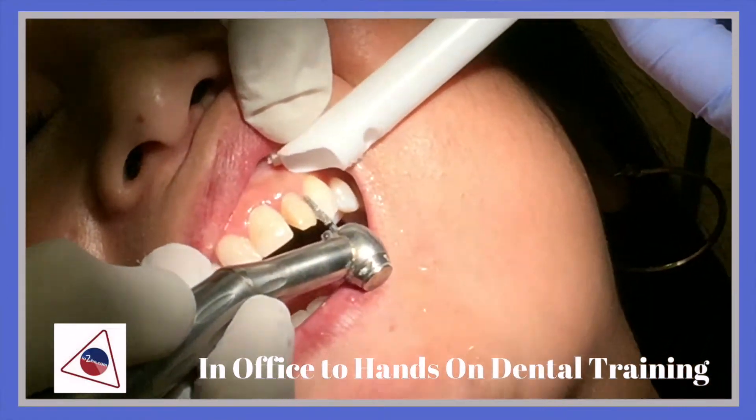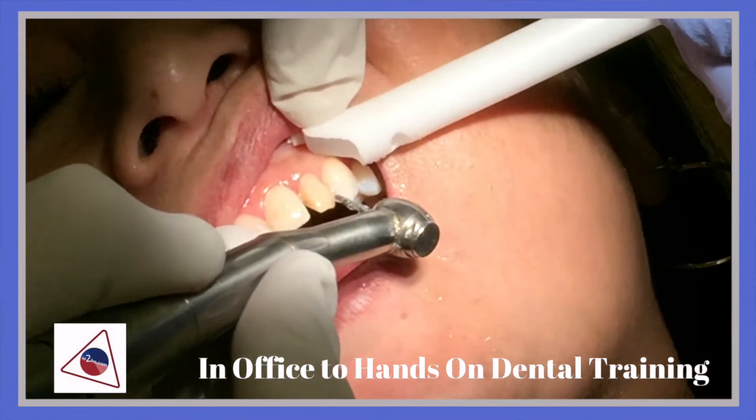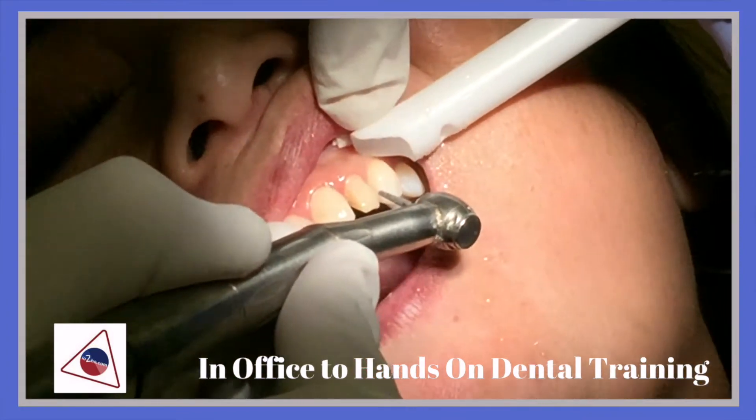Now I'm going to go the same way and work on the distal side of this tooth.